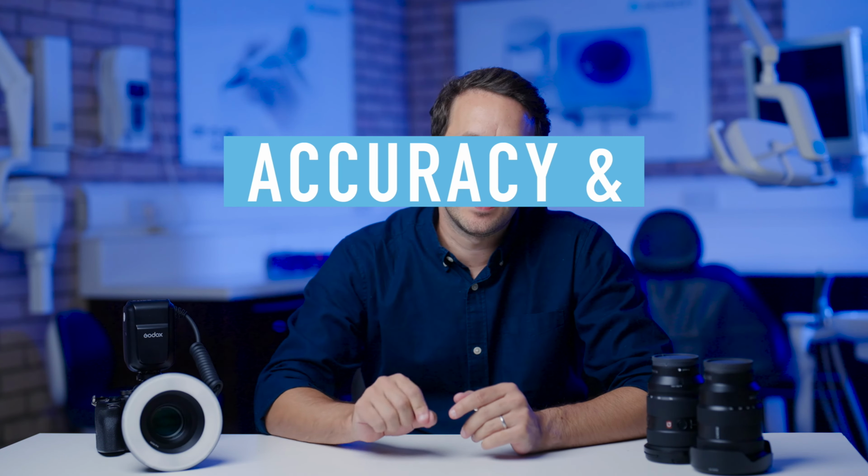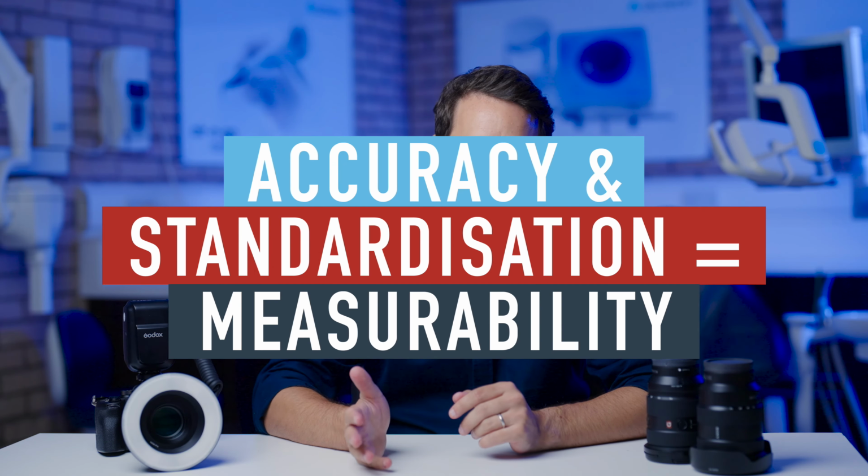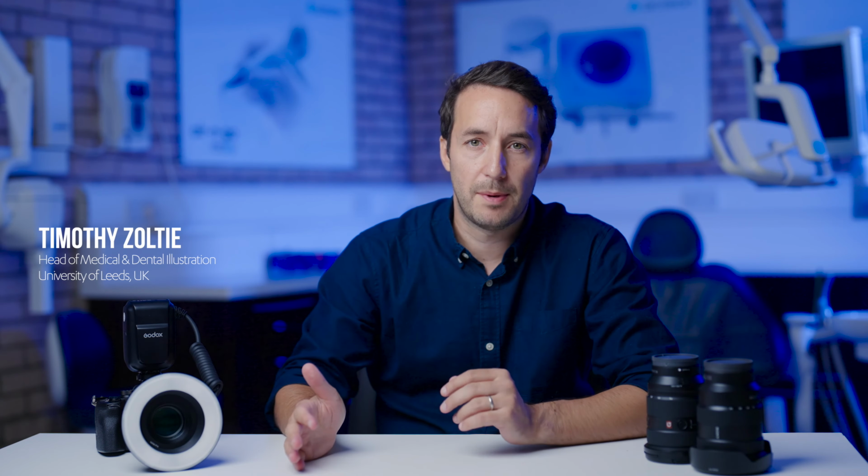I always say accuracy and standardization equals measurability. You need to be able to take a picture using the same settings from the same perspective over a period of time that can span from weeks to years. Incorrect positioning and angle can lead to perspective distortion and affect the perception of size.